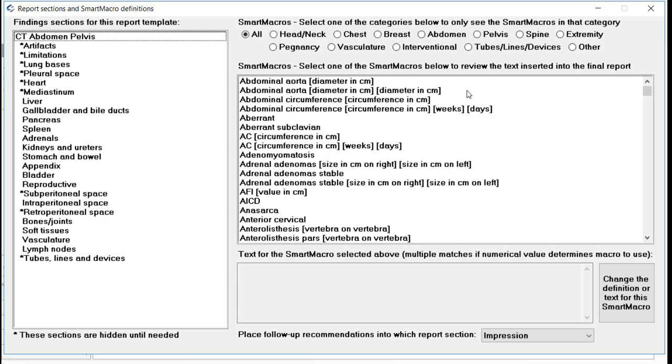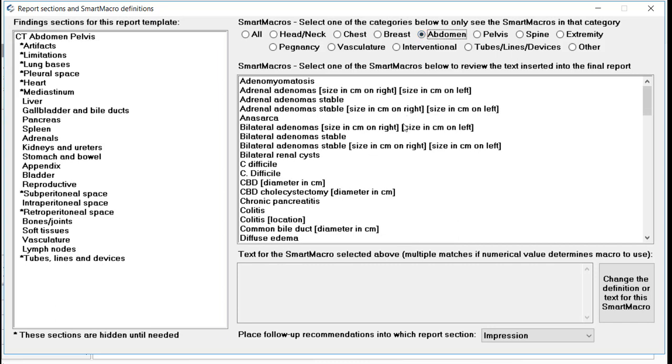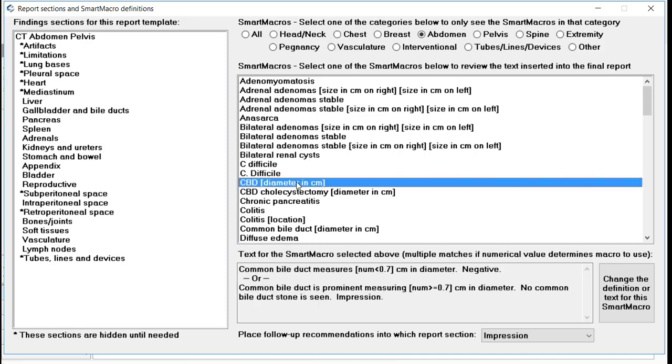Note you can limit the list to a certain type of smart macro by picking the radio button at the top of the window. Let's select the abdominal smart macros. Note that there is a smart macro for common bile duct size. If we select this smart macro, we see that the text generated will actually differ depending on the number inserted into the smart macro. For a diameter of greater than or equal to 7 mm, a statement is placed into the impression stating that there is an enlarged common bile duct, but no common bile duct stone.